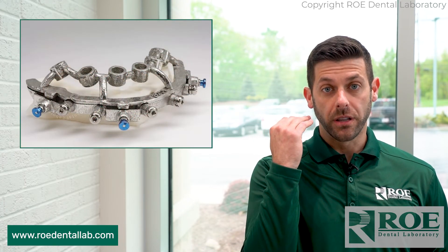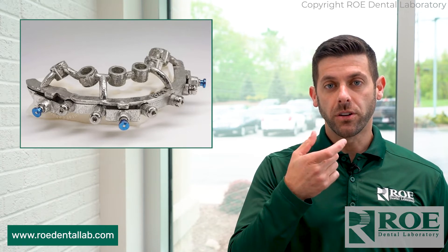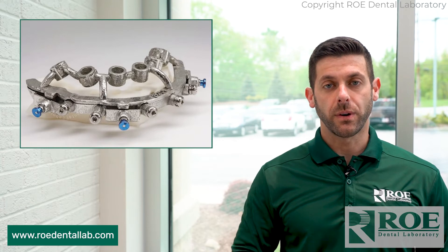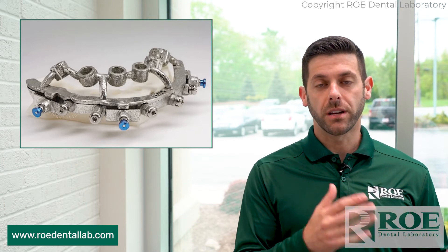that is also your bone reduction line. So we're going to reduce bone down to the fixation base. Then all you do is take your osteotomy guide and it locks right into the fixation base — no need to pin and repin like the bone channel guide.